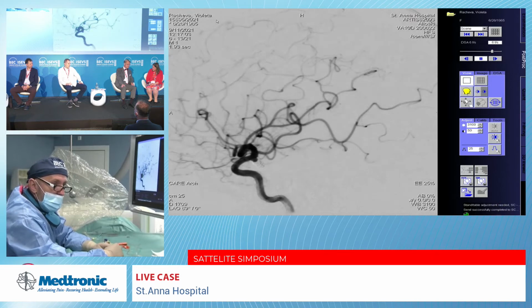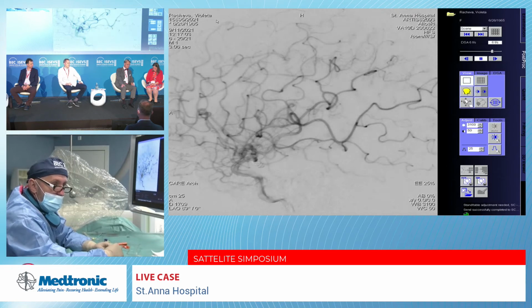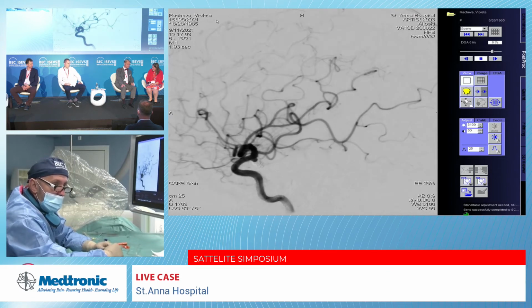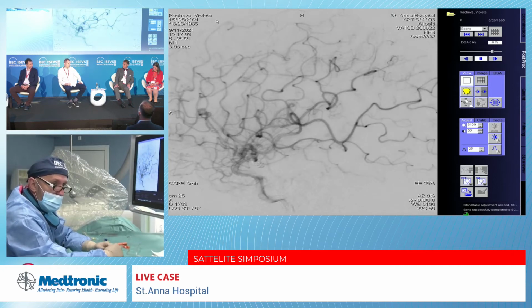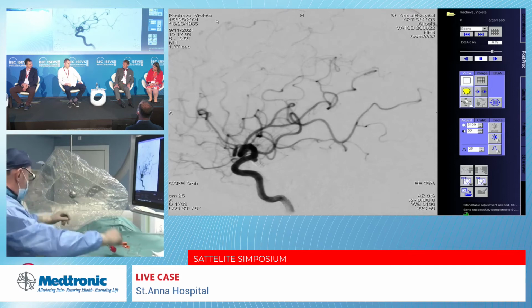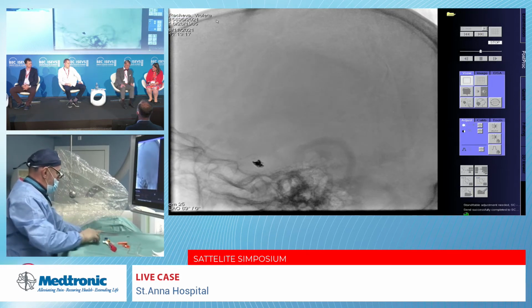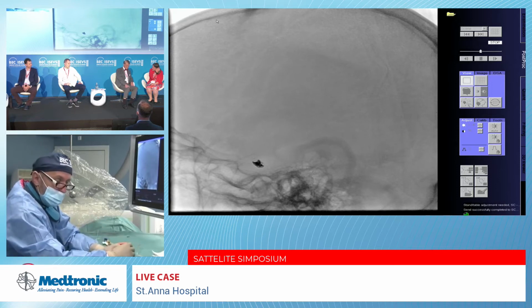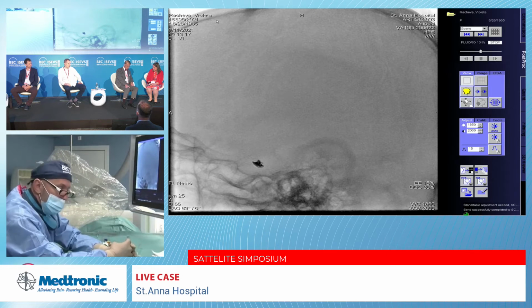The one lady was allergic to aspirin, and the second one had a history of very severe stomach bleeding. So we decided to put these two patients on it. We already have the first control at 6 months, nothing special, no strokes. Again, we didn't observe any in-stent stenosis or hyperplasia. So maybe this coating of the stents, like you mentioned, shield technology, could potentially change the guidelines in the future, and we stick to the monotherapy with these stents.